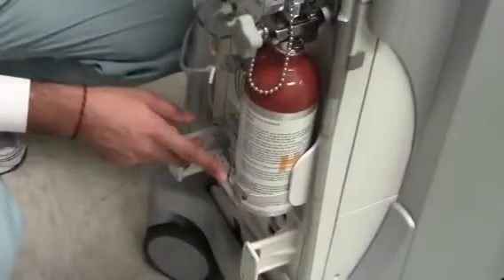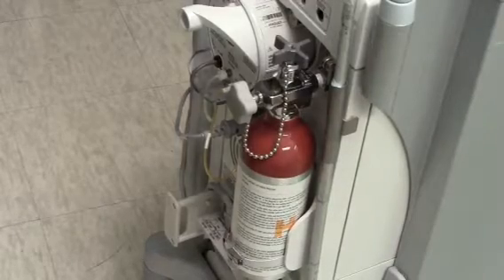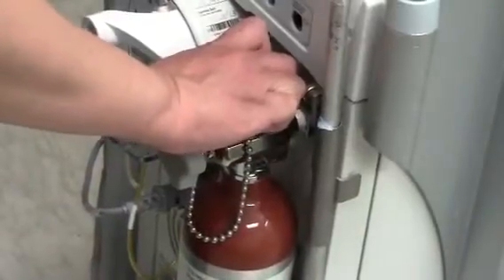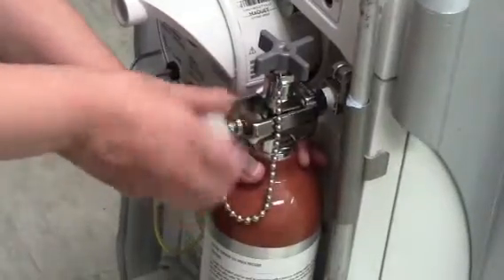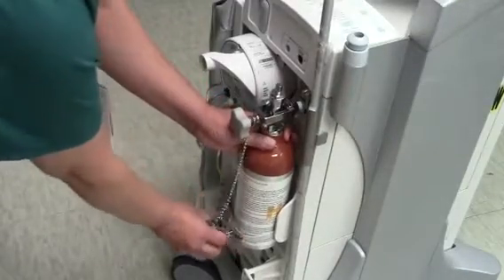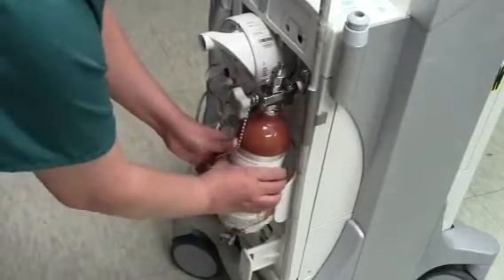So right now, to demonstrate: you want to make sure the helium is off by turning to the right, turn the knob to the left, and then take that latch off — and it will come off.